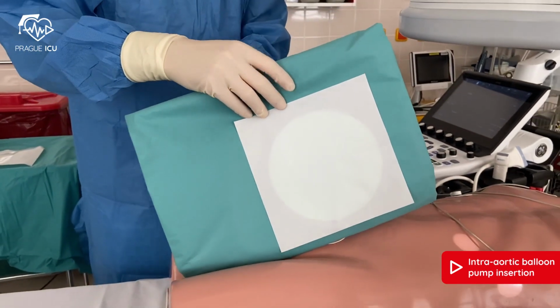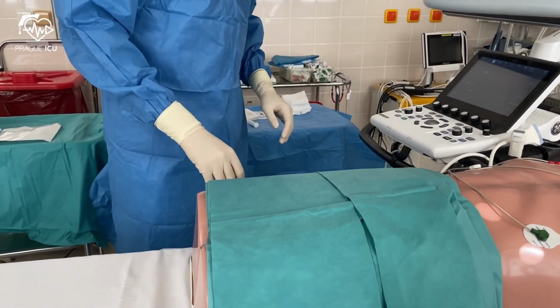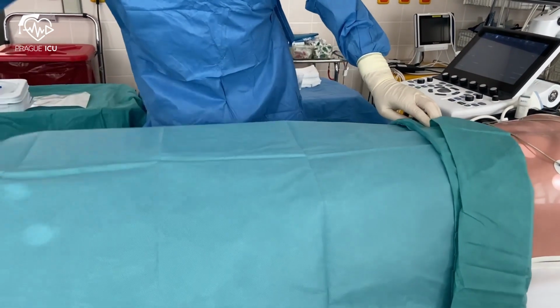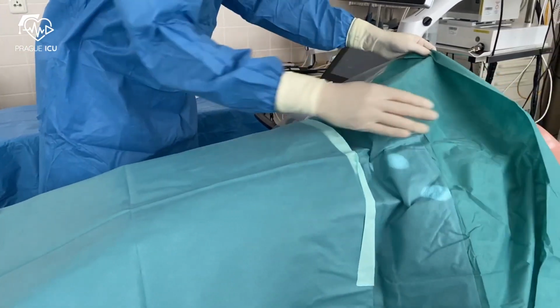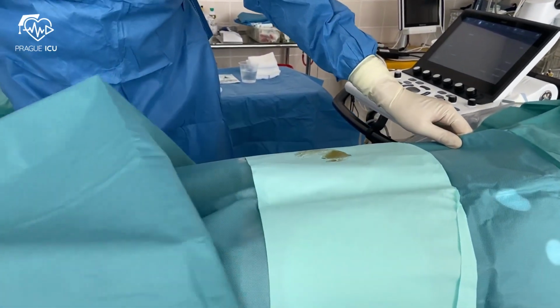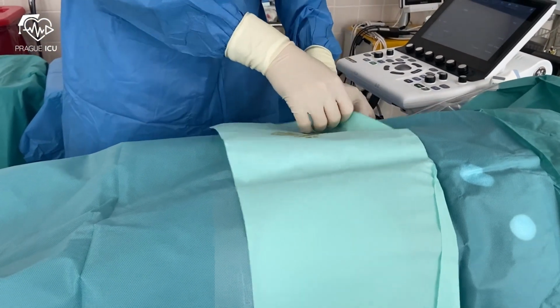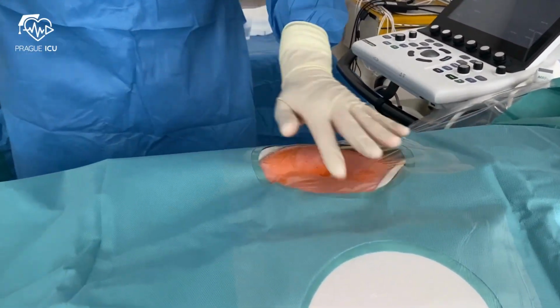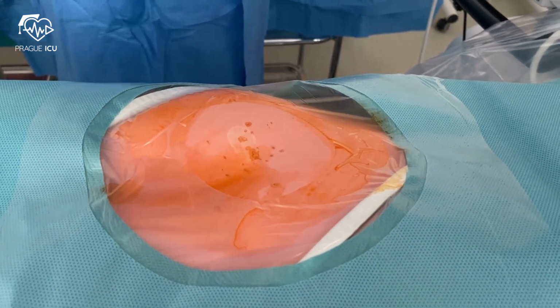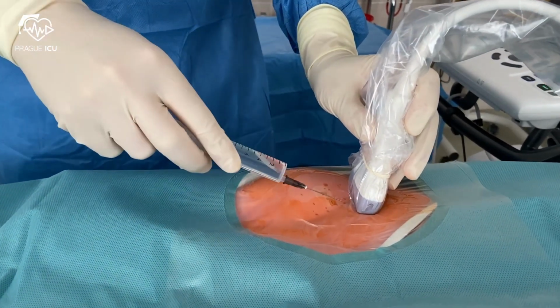Then drape the intended area. Anesthetize the skin and subcutaneous tissues with a local anesthetic.